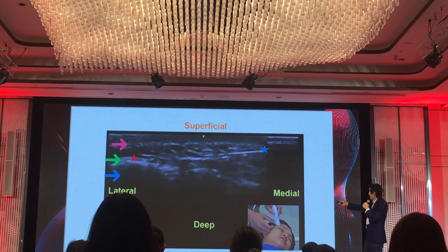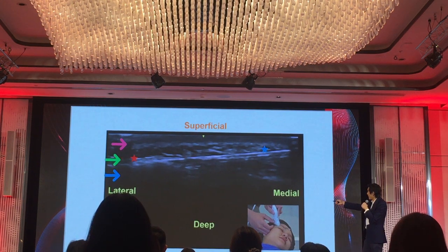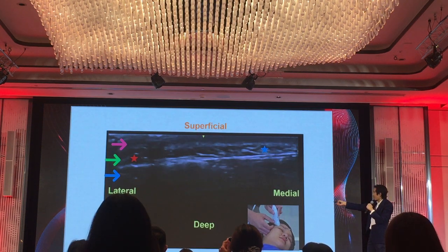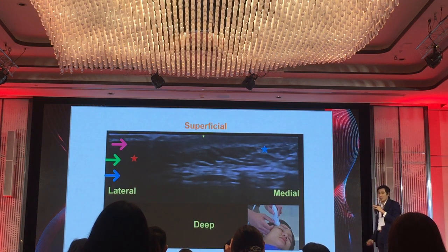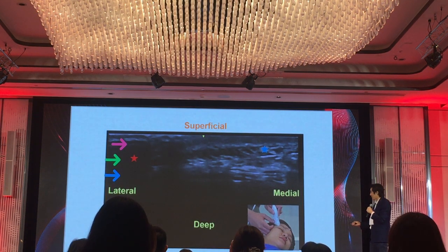See that? In this area, the cannula penetrates the superficial temporal fascia, and the anchoring point is in the interfascial plane. You can see the black round shape here on the red star, which is the superficial temporal artery, embedded inside the superficial temporal fascia. Okay. So I'm sure that this one will be effective and safe.